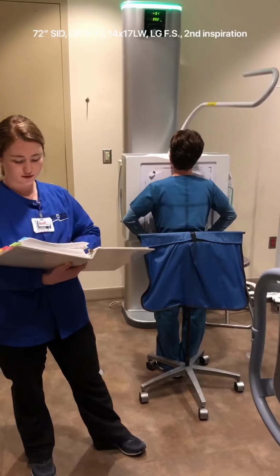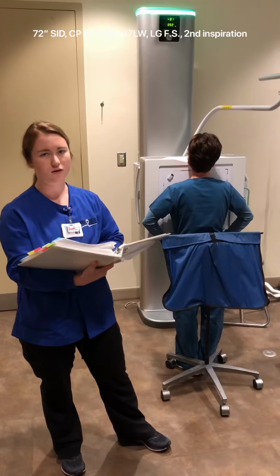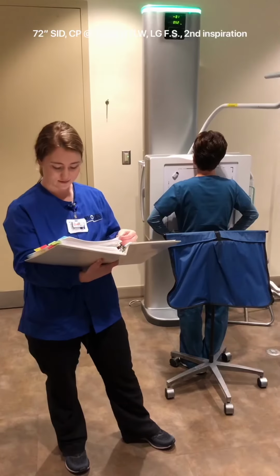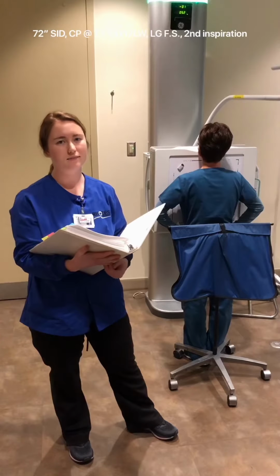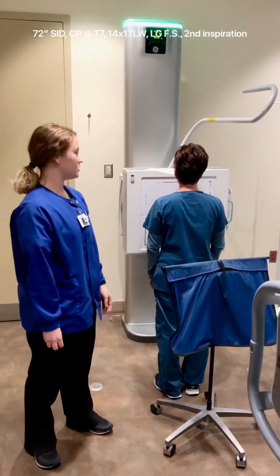You want to make sure you're on wall bucky, set at large focal spot, because you don't need the fine detail that you would need with bone x-rays. Then make sure you tell her to take a deep breath in, blow it out, and then take another deep breath in and hold your breath. Take the lateral chest x-ray.